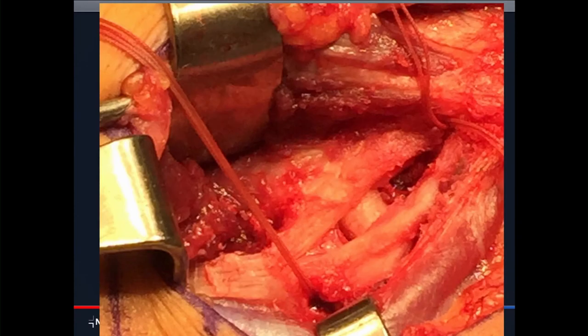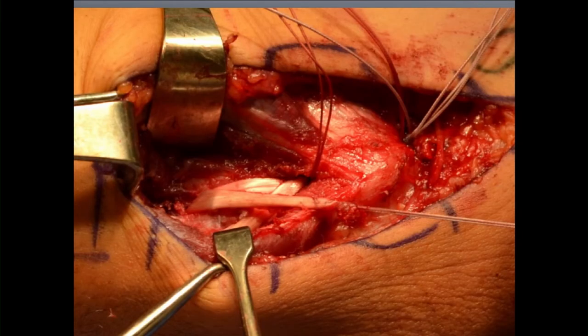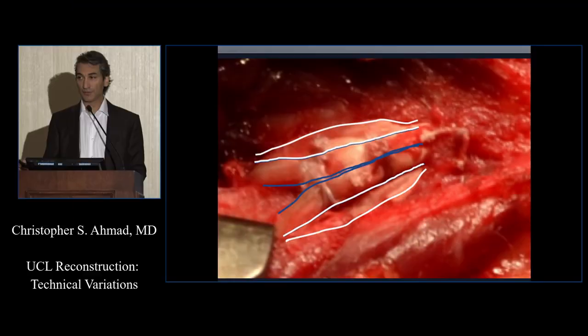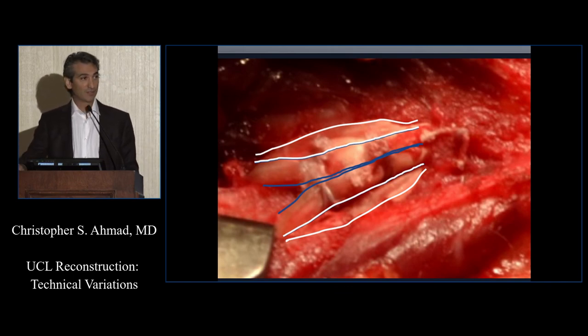How about four strands? Love it. Look, we got four strands. We went all the way around, we came all the way back, and now we can put this in, and now we have four strands. So when I see him in the holding area or the post-anesthesia care unit, and they say, how many strands did you get? If I say four, I leave it at that. If I unfortunately got two, I always tell them it's the biggest two I've ever seen.